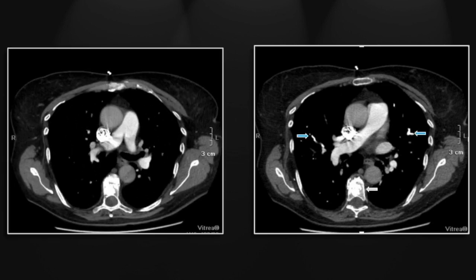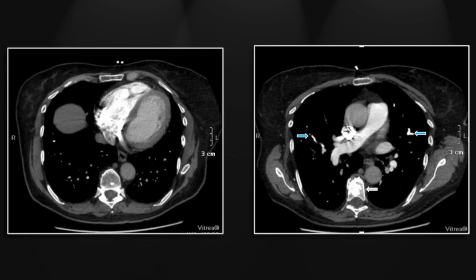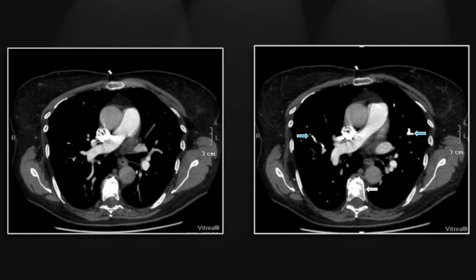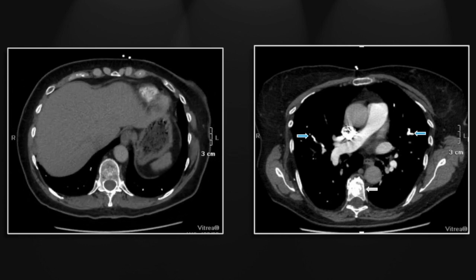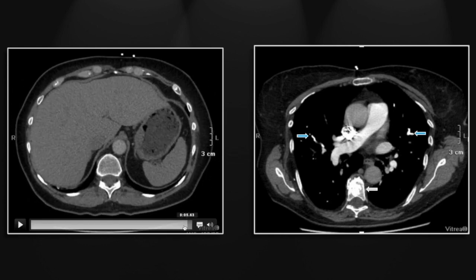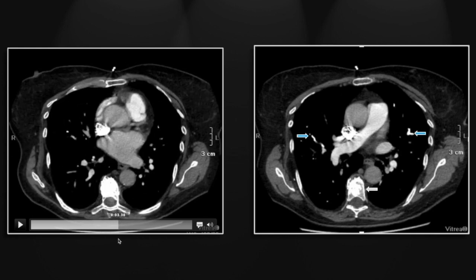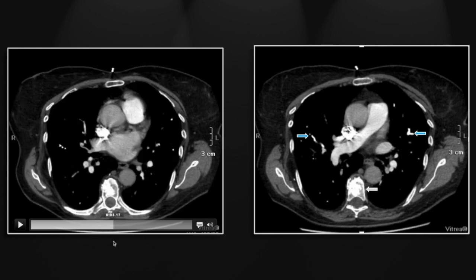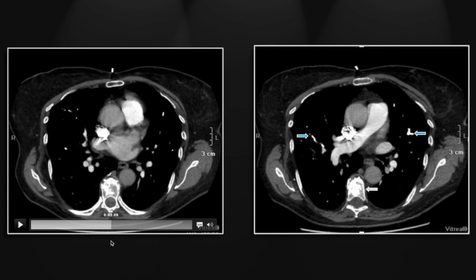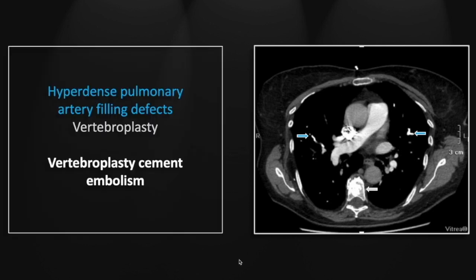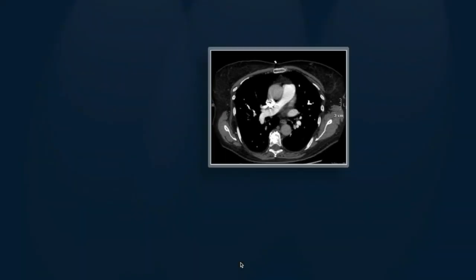On the cine, you can appreciate the many locations of dense contrast throughout both lungs. You can also again see that vertebroplasty cement and the extravertebral and venous cement. So that's a case of vertebroplasty cement embolization.